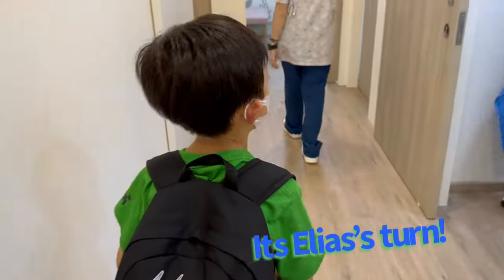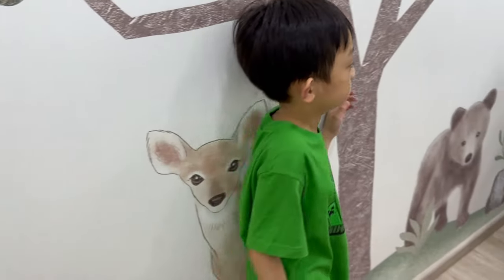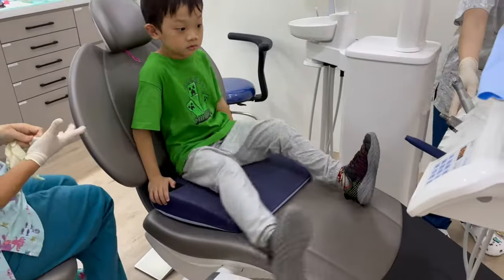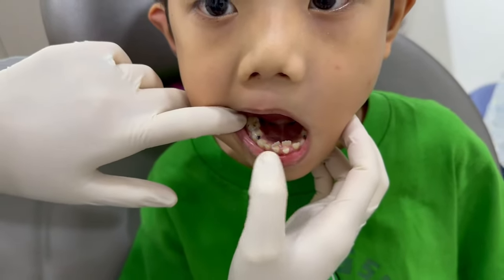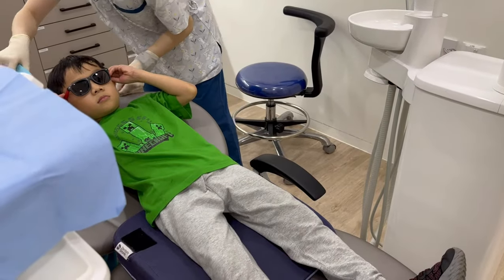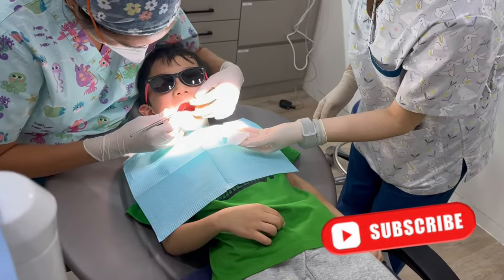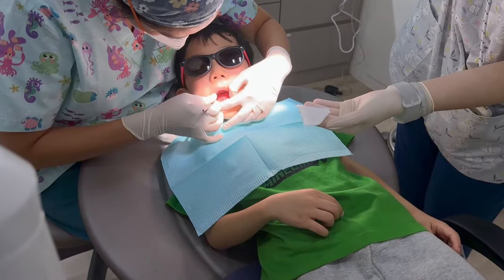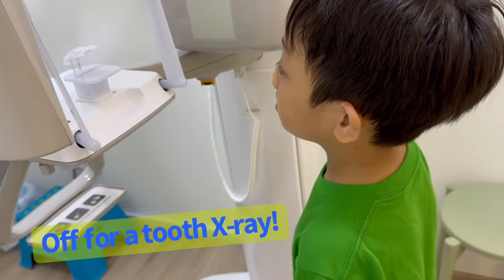It's Elias' turn. Okay, you sit on the chair there. See this part that we felt was like crooked? So I'm not sure if it's overcrowding right now. He's got multiple cavities — some have stopped, some have not. Elias is going to get his tooth x-rayed.